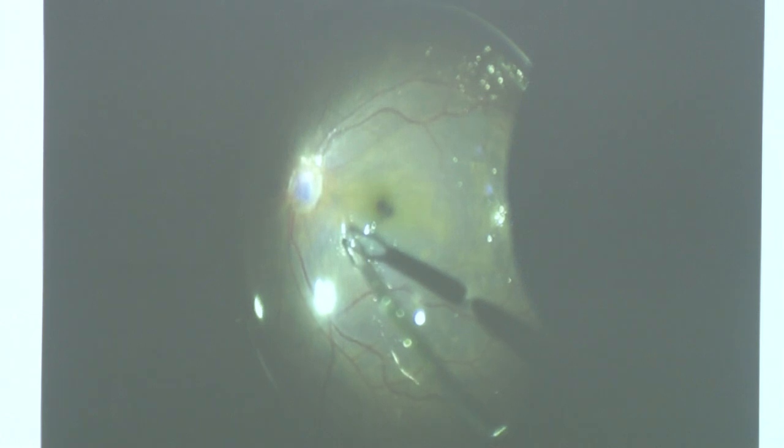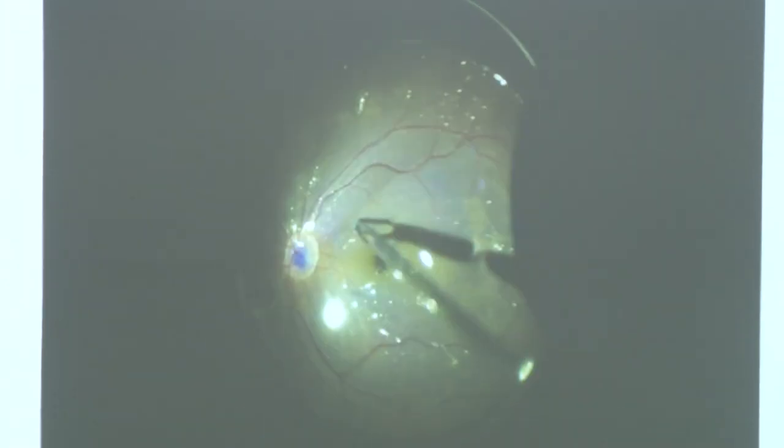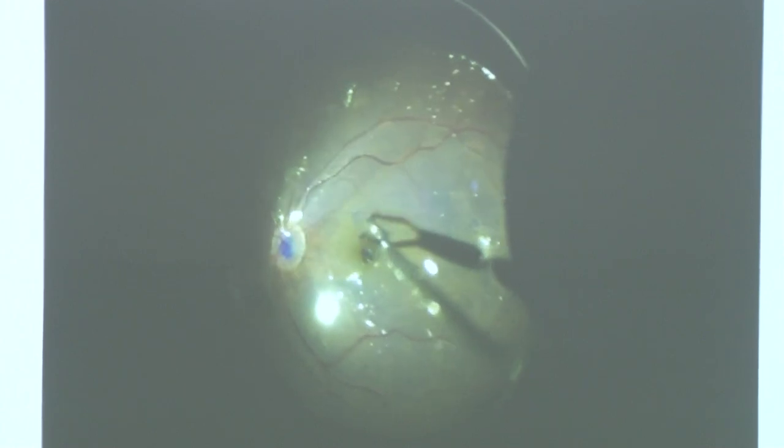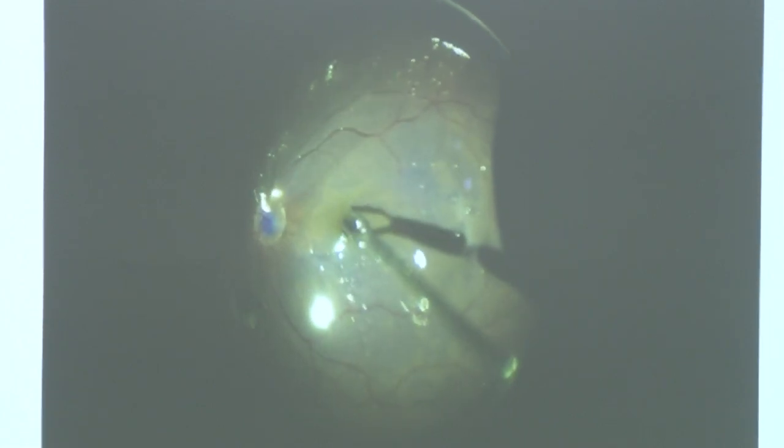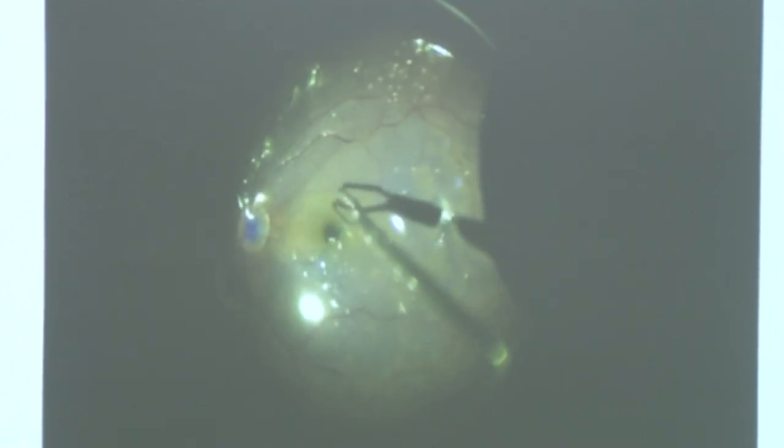This is a case of failed retinal detachment surgery. A technique was done for retinal detachment but there was re-detachment, with membranes over the macula and thin PVR membranes. We decided to put PFCL, stain the ILM, and remove all the proliferative tissue along with the internal limiting membrane, then drain through a retinotomy and put silicone oil. Removing ILM over a large area gives a relatively relaxing retinotomy-like effect in failed retinal detachment cases.